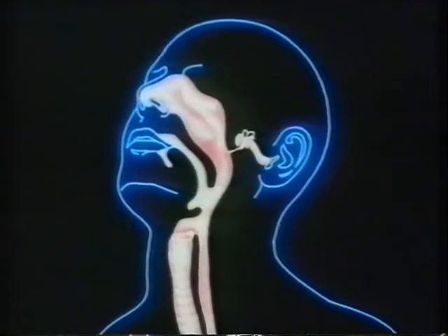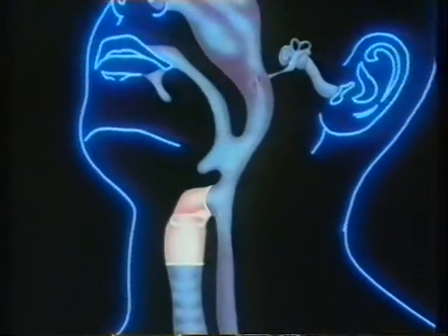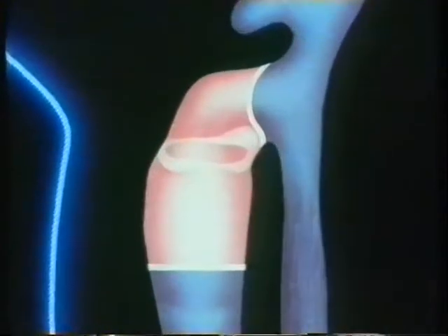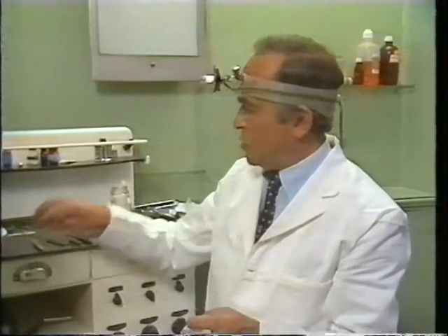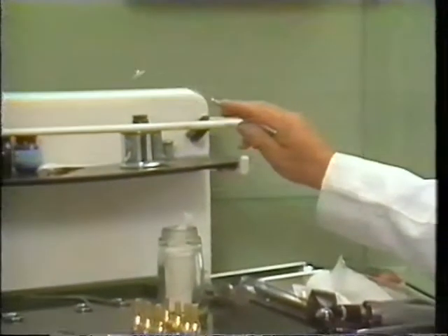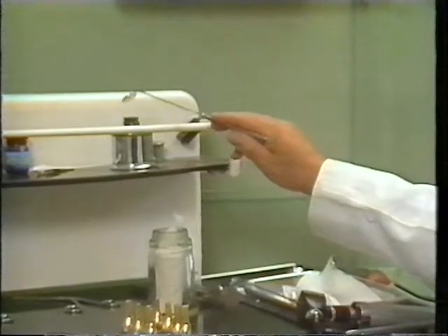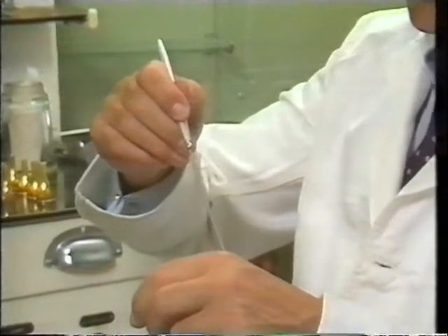Moving down then, we reach the larynx. Local anesthesia of the oropharynx with a xylocaine spray may be helpful or even necessary before this area can be examined. In order to see into the larynx, a laryngeal mirror 20 to 22 millimeters in diameter is needed. This is warmed over the spirit lamp flame in the same way as the postnasal mirror was, and the temperature checked.